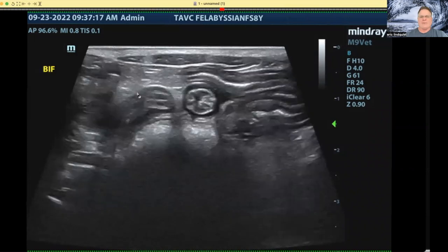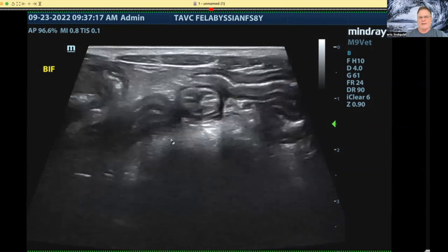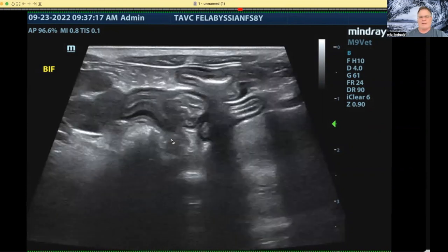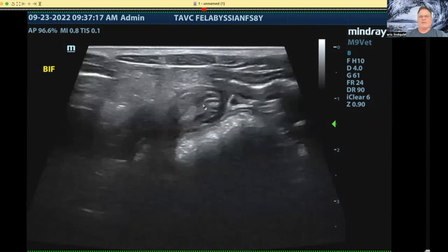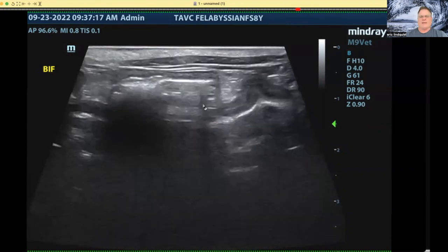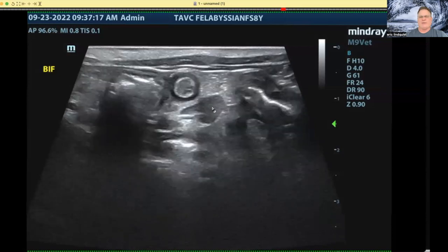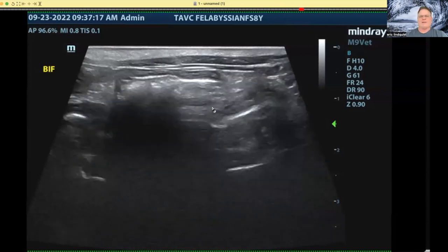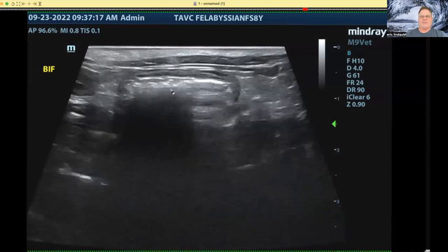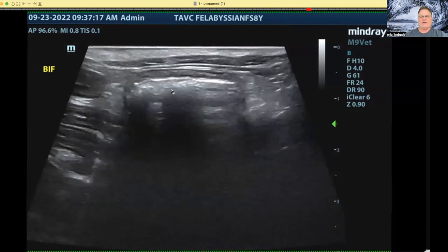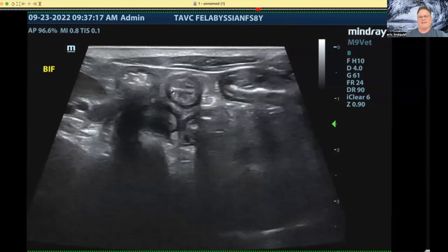We see the ileocecal valve here — this is the typical wagon wheel of the ileocecal going into the cecum. I look for the dirty shadow and then back it into the ileum until I get the wagon wheel — that's how I get the ileocecal. You can see some mesenteric nodes that are fairly normal to slightly enlarged, with the length-to-width ratio maintained. That's the ileum going into the cecum — what you want to try to find. You can also sweep between the kidneys to get that as well.